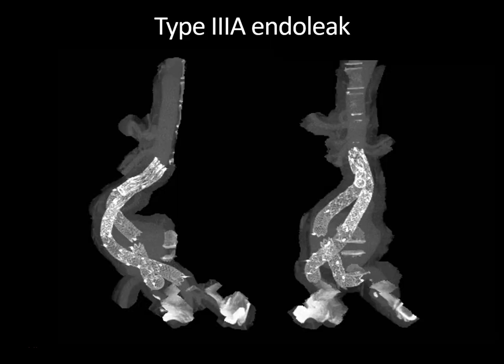Often with type 3 endoleaks, the reformatted images better show the graft disconnect. These 3D MIP reconstructions show the disconnected limb on the sagittal image and on the coronal image very nicely. Here's the normal contralateral limb, and this is how it should normally be connected.